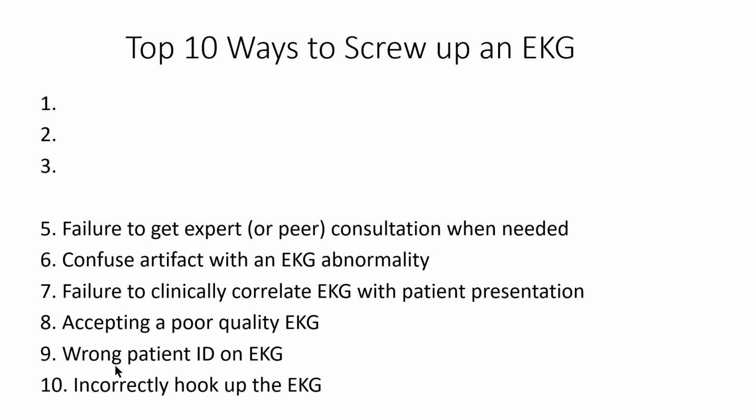Next up is failure to get expert or peer consultation when needed. Early on, I recommend that you have somebody else with some experience look at your EKGs with you. Also, if you have a high-risk situation where you think the EKG is abnormal, or you thought it was going to be abnormal and it wasn't, something's not adding up, or you just need some additional input before you make a clinical decision, you should feel free to consult cardiology, particularly when the stakes are high.